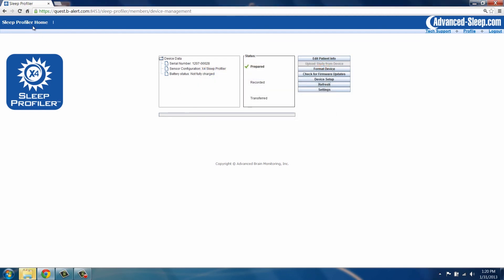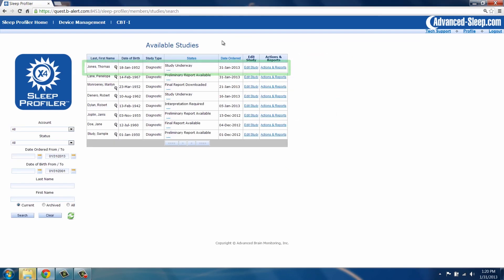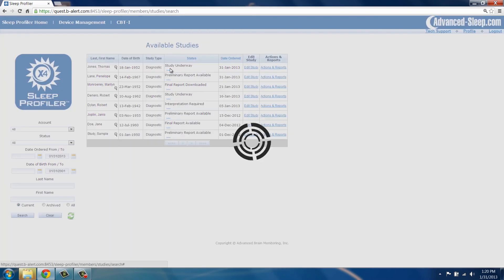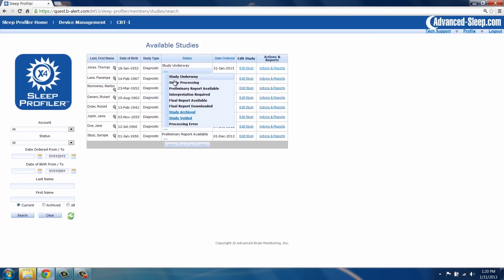Locate the study to be voided on the home page. In the status column, change the status to Study Voided. Be careful, voiding a study cannot be undone.